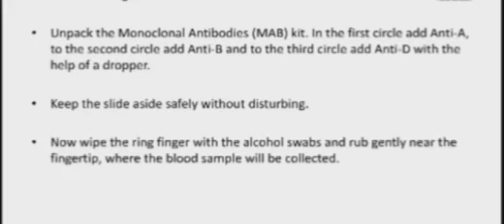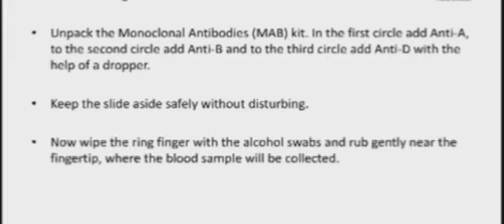In the procedure, take a clean glass slide and draw three circles on it with a marker. Unpack the monoclonal antibodies — the MAB kit. In the first circle add anti-A antibody, in the second add anti-B, and in the third add anti-D solution using the dropper provided in the kit. Keep the slide aside safely without disturbing it so that the drops do not mix with each other.